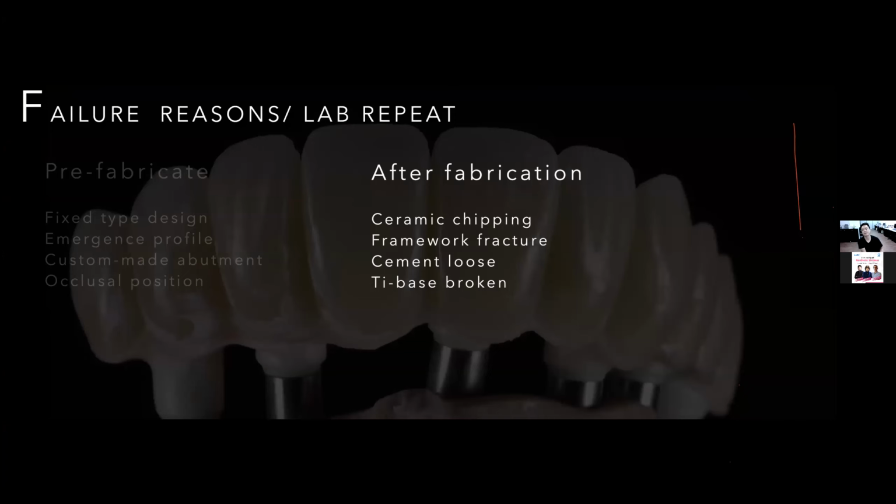But when you send the case to your dentist, sometimes the problem is the repeat. Maybe it's very difficult because when dentists set the crown and finish it in the patient's mouth, if there is some problem for us, repairing and adjusting is not easy. So sometimes after fabrication, the problem cannot be solved. So if possible, we need to design to prevent this problem.